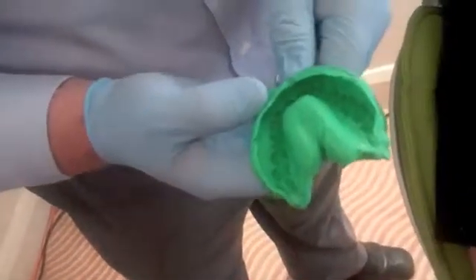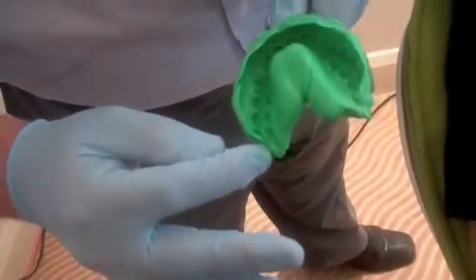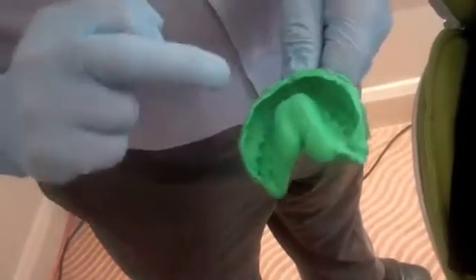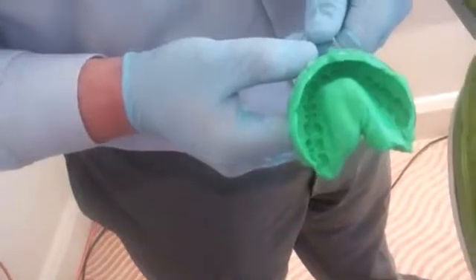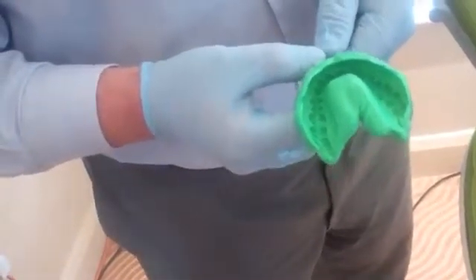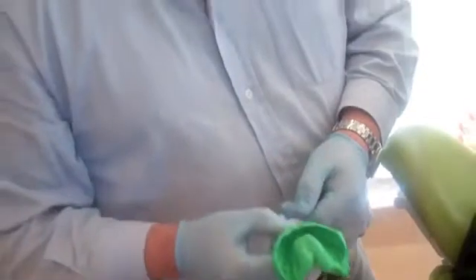I've got all sorts of stuff over my gloves, which is unpleasant for me. But you can see here drags where the impression has not been completely accurate around the wisdom teeth. On this side, you have a drag. We have some marks here where the impression is not complete, air bubbles on the teeth, and areas where the impression has not 100% replicated the exact situation in the oral cavity. Would you have had to repeat that impression? It would depend what I was planning on using it for — there are levels of accuracy that are needed. For example, in something like Invisalign, that would be a case where you would have to retake this impression.